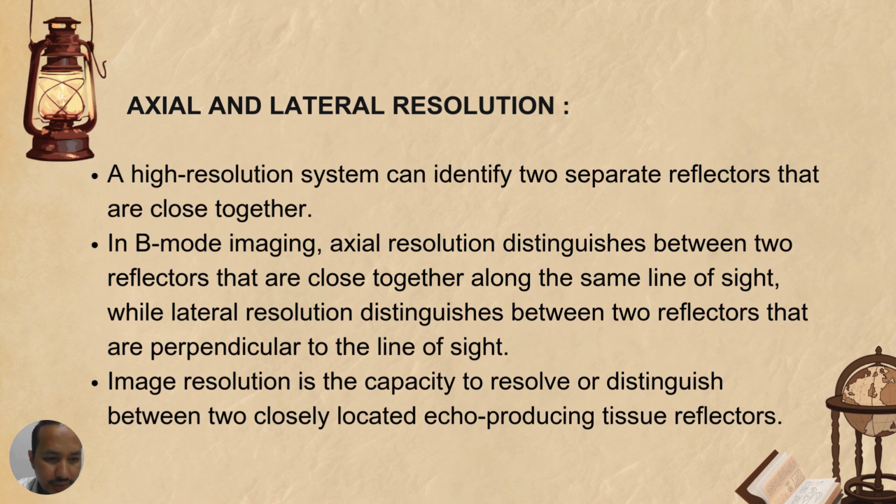And image resolution is the capacity to resolve or distinguish between two closely located echo-producing tissue reflectors.